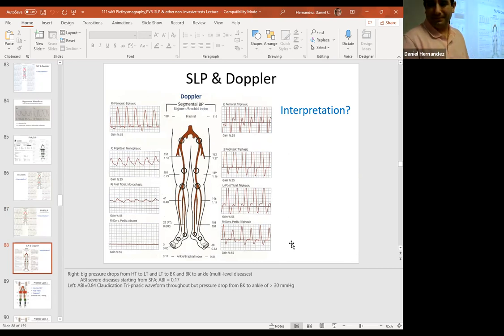Yeah, his toes are going to be cut off right below that. It's nothing. It's gone. So they couldn't even hear a dorsalis pedis, so they weren't able to insonate a dorsalis pedis. And posterior tibial, they got a pressure of 22. So his ABI, PTI is 0.17. Yeah, so that's critical. You're gone, leg. You're not leaving. We're going to have to do something.